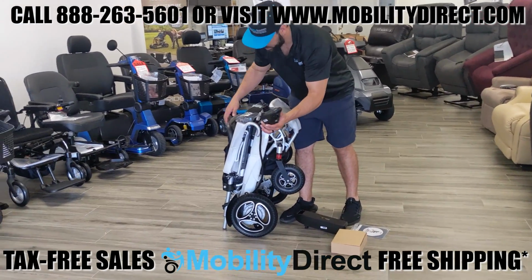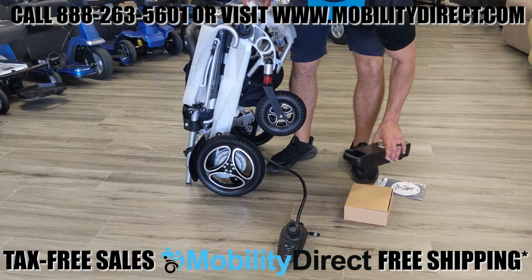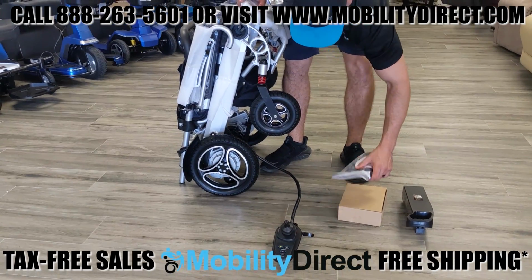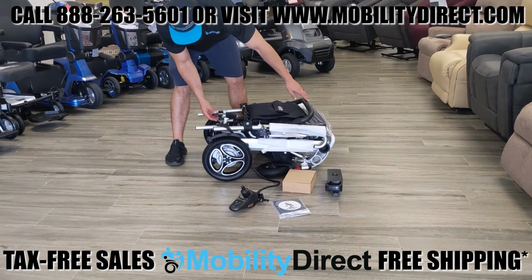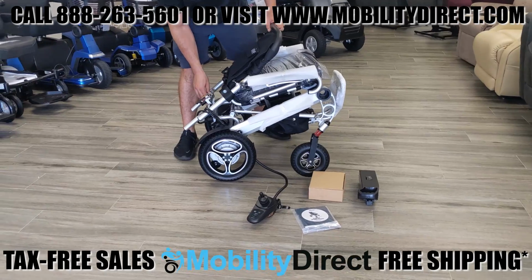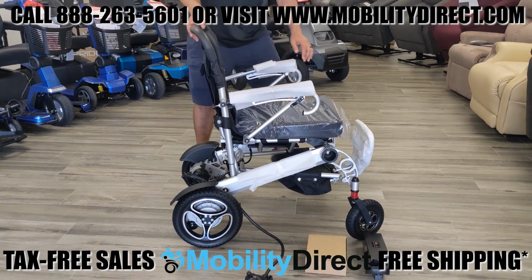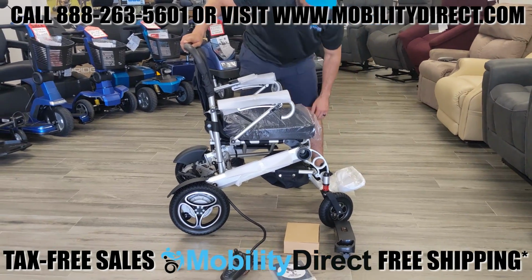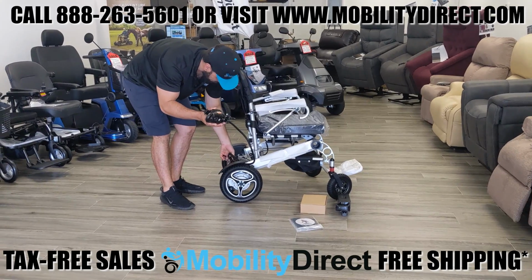We're taking the time to put the joystick on the floor very carefully so that it doesn't fall during the unfolding process. Unfolding the chair is very easy. There is just a latch on the back which already comes unlatched. So what you need to do is lay the chair flat like this and then pull the backrest up while pushing the seat forward in the opposite direction as shown here. You can then lower the foot plate and begin to get ready to install the joystick.